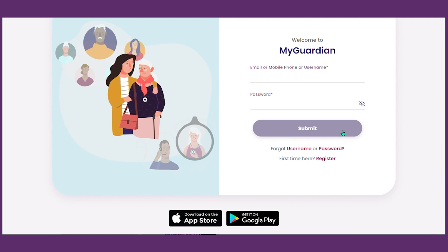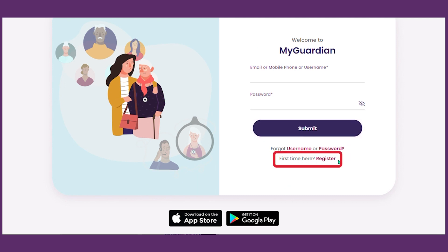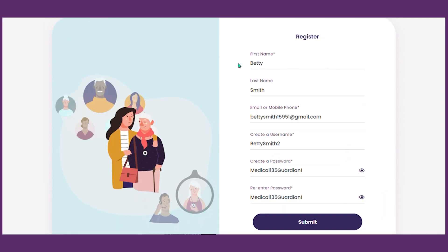If this is the first time visiting the site, click register. You will be asked to enter your first name, last name, email address, or cell phone. Then you will be asked to create a password.